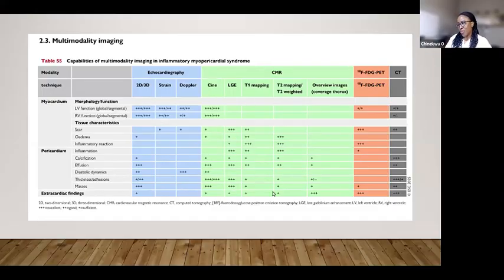As much as we know that cardiac MRI is much stronger than echo in some things, we cannot ignore the ease of access of echocardiography. Every patient can have a version, no matter how big they are or how unwell they are, you can get a machine to their bedside and put a probe to their chest. Echo is quite good in estimating function and volumes, but MRI is probably stronger.